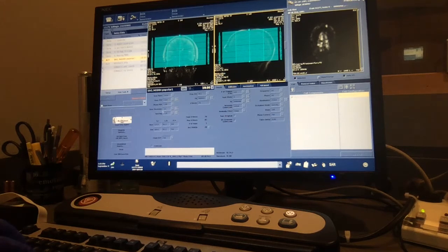We have a slice thickness of 3.6 millimeters, but with a slice gap of negative 1.8 millimeters. A fairly long TR, 9,000 milliseconds, acquiring across 76 slices. For frequency and phase encoding, we did a 96 k-space base.